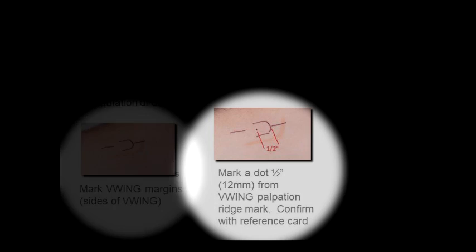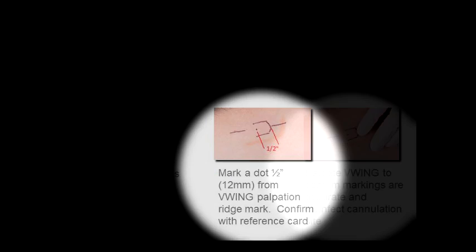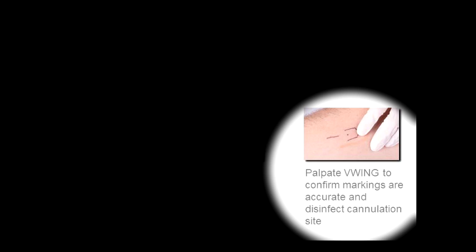3. Palpate the V-Wing with the tip of the finger and mark the location of the palpation ridge. 4. Palpate the V-Wing and mark the margins or sides of the V-Wing. 5. Mark the cannulation site 1/2 inch from the palpation ridge mark in the direction of the bowl of the V-Wing. The mark should be in alignment with the palpation ridge mark and the fistula marks. The cannulation reference card may be used to indicate the 1/2 inch distance. 6. Palpate the V-Wing to confirm correct location of markings and disinfect cannulation site per protocol prior to cannulation.